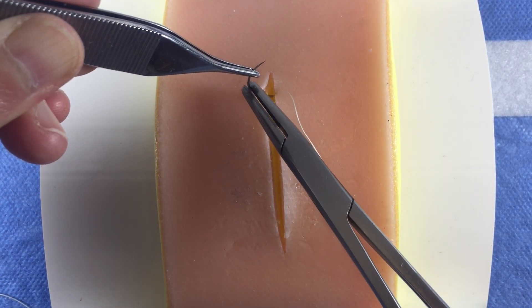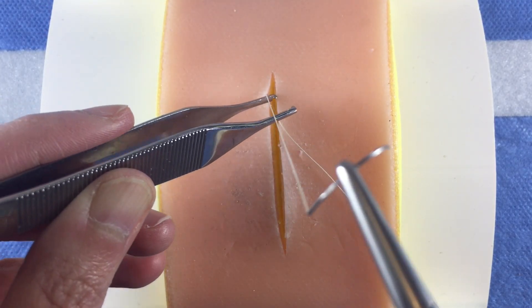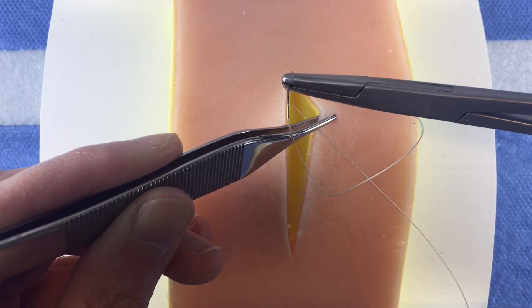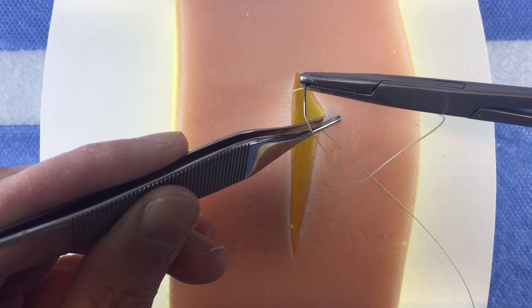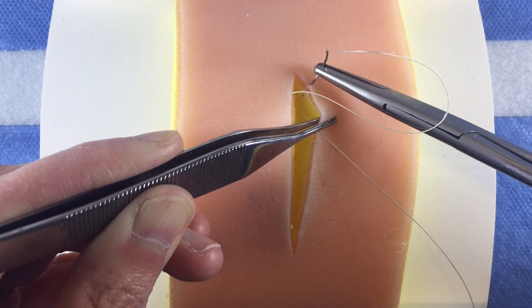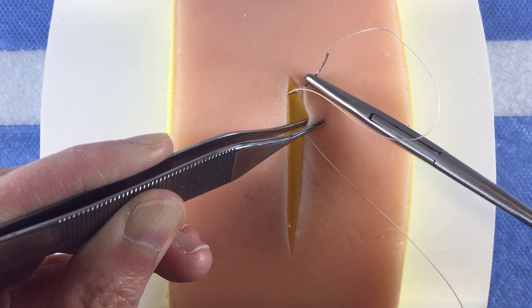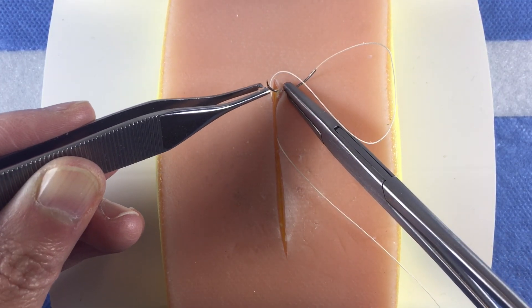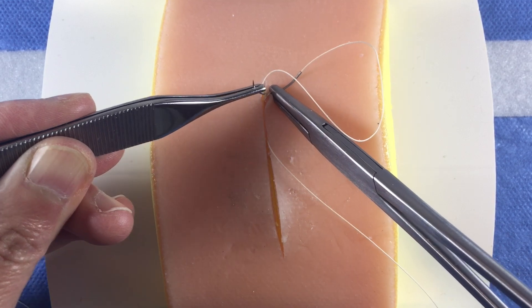Next, reload your needle. Grasp the skin on the opposite side and evert it in order to show yourself the dermis. This next motion is going from superficial to deep — enter the superficial dermis just below the epidermal-dermal junction and drive the needle vertically to come out the deep dermis.